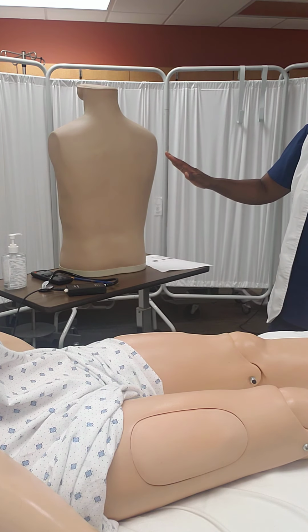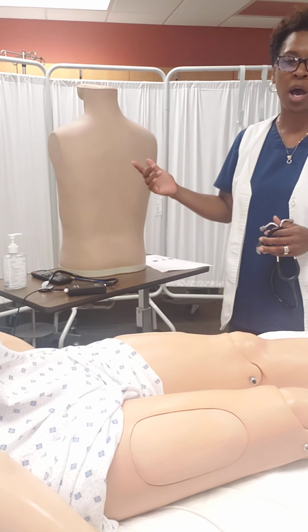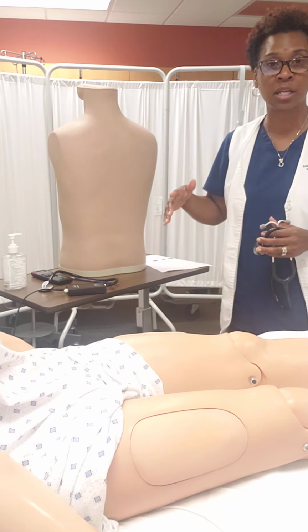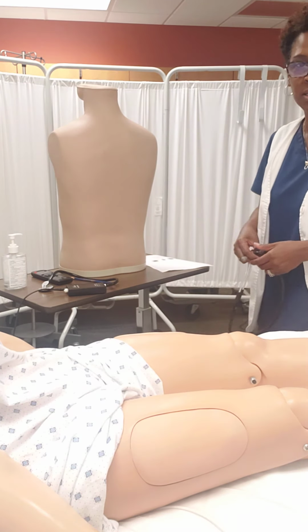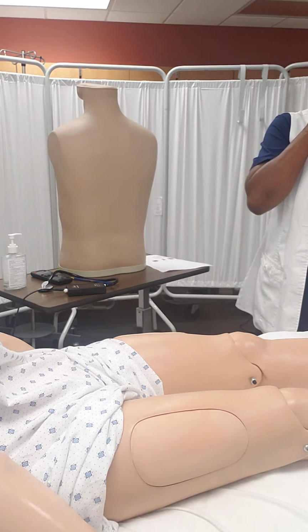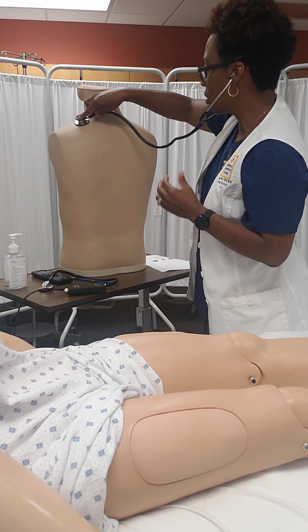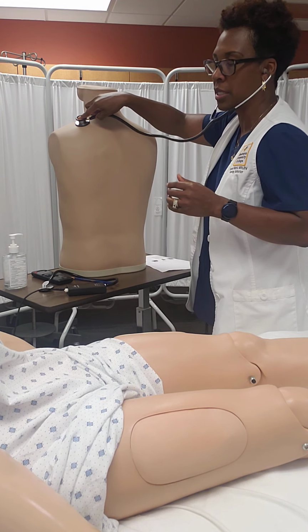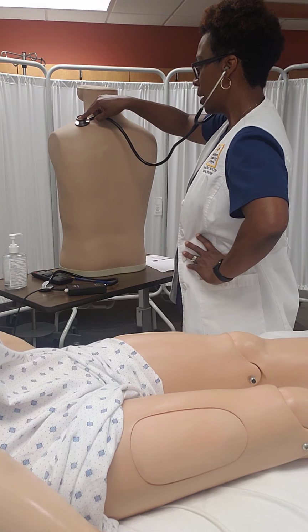I'm going to go ahead and listen to the lung sounds before I do the chest expansion test and tactile fremitus test. So I'm going to listen to the lung sounds posteriorly. You can start over here and listen, and you ask your patient to take a deep breath in and out before you move your stethoscope. Okay, patient.